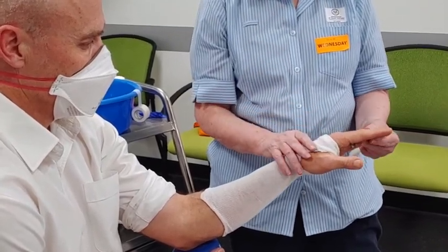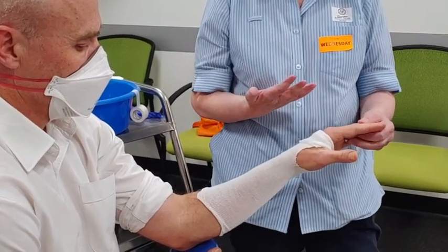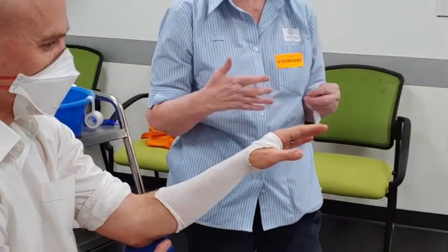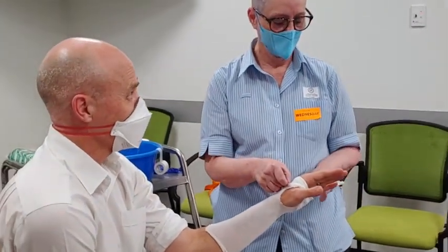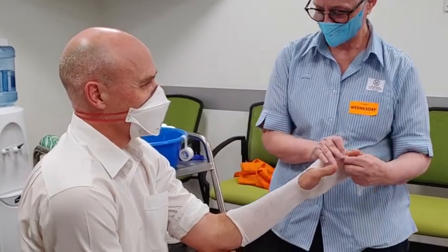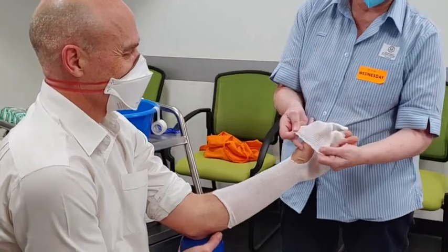All casts are really resting casts — they're not active wear. You don't want patients going out rowing or doing all that sort of thing; they'll rub away all the padding inside. Then we take the thumb and pop this over like so.